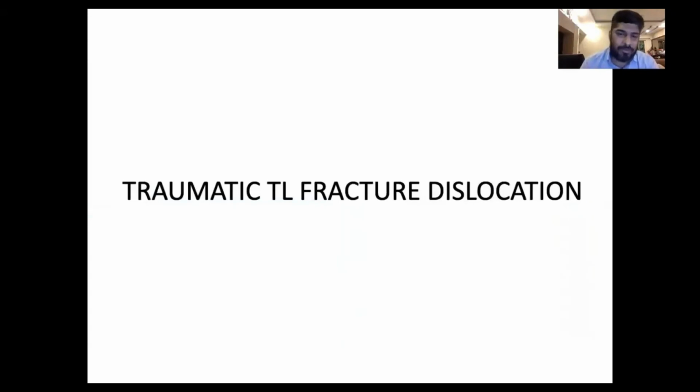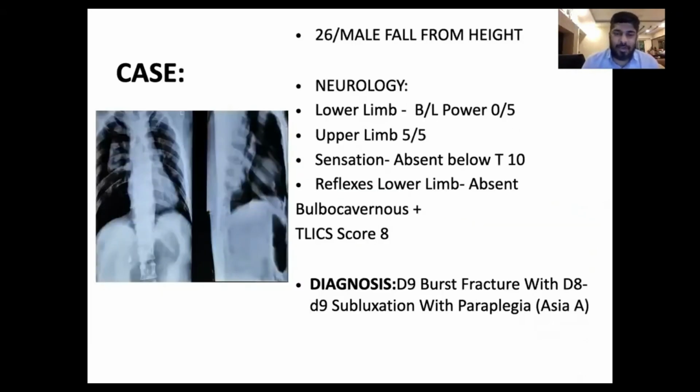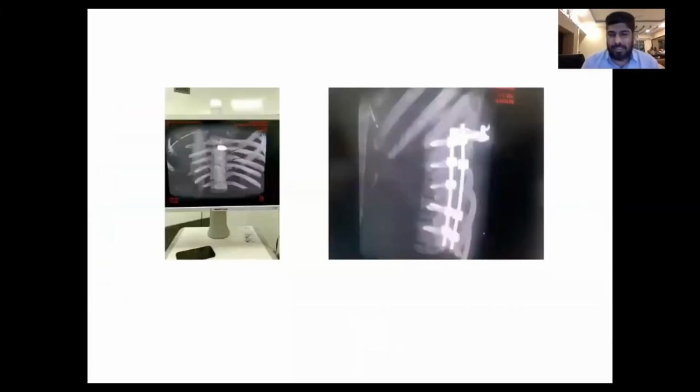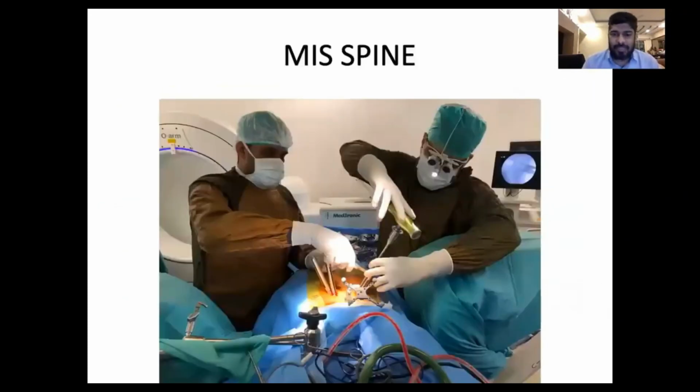And fractures, thoracolumbar fractures, where we can have various different types. And in this particular case, there is a 3-column injury with lower limb power 0. There are again associated injured ribs. We can really plan your fixation well, strategically, and really get out very fast.